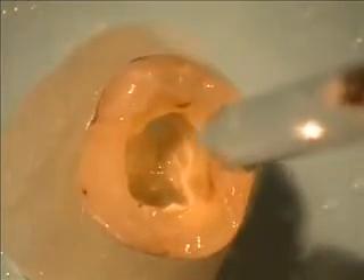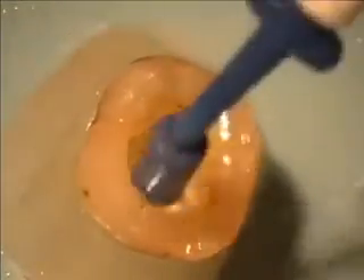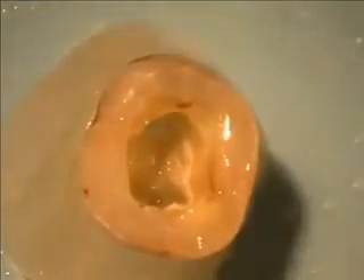The cavity has been dried for five seconds. Two more brush coats of Simplicity Two are applied, and the cavity is dried again for five seconds.